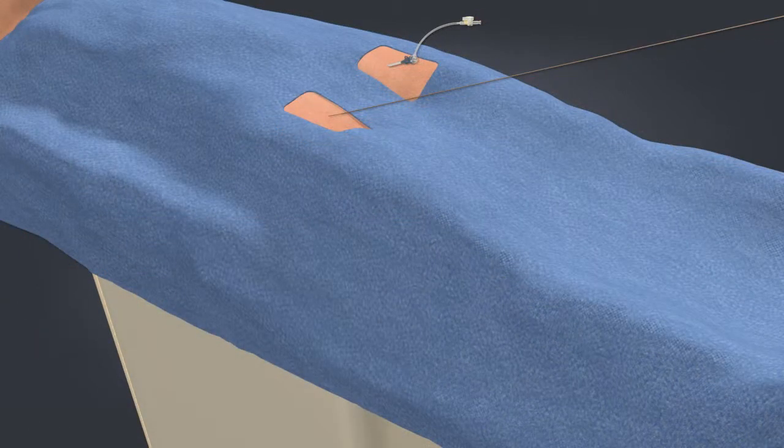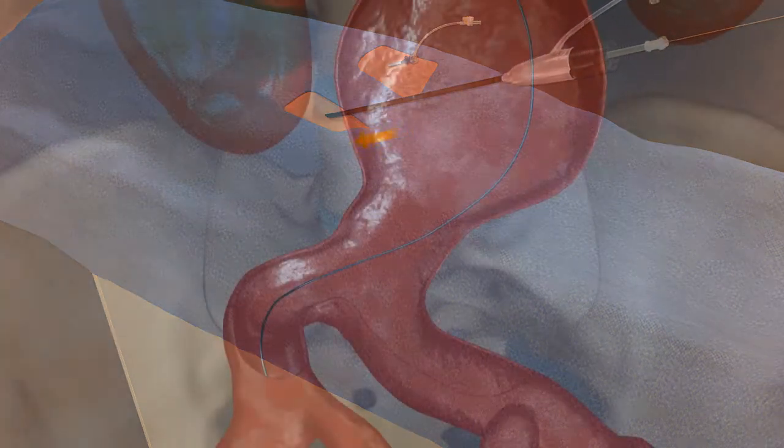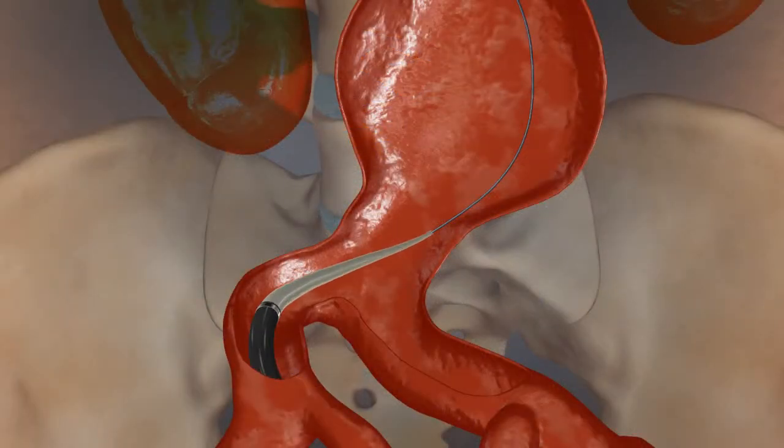On the ipsilateral side, place the 17-French AFX introducer sheath over the guide wire and advance through the arteriotomy and up to the aortic bifurcation.